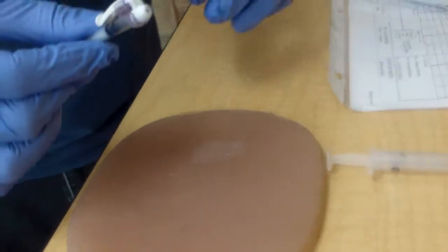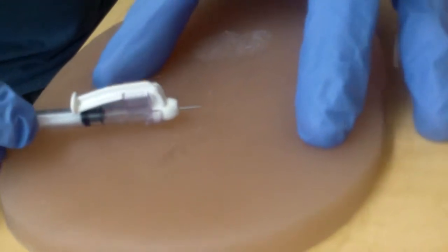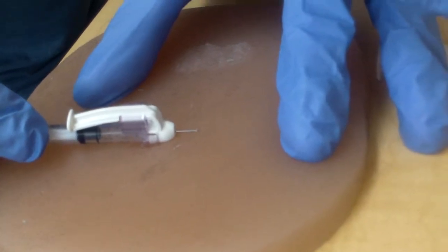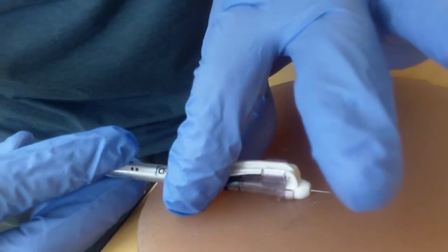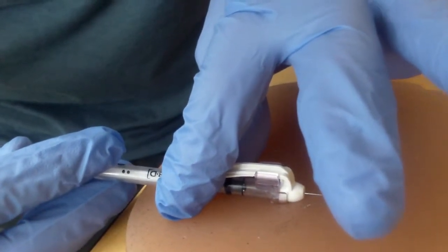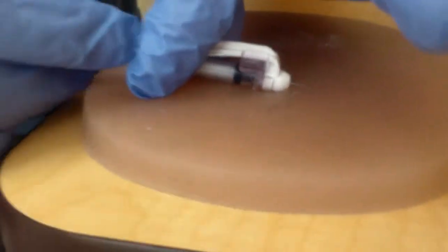So the bevel is up, and then I'm going to make sure, I'm going to spread the skin so it's nice and taut, and then I'm going to just slide the bevel right underneath the skin, make sure the skin is taut, and then I'm going to stabilize, and then slowly inject the medication underneath the skin, and should be able to see a wheal form. Just a little bit one there.